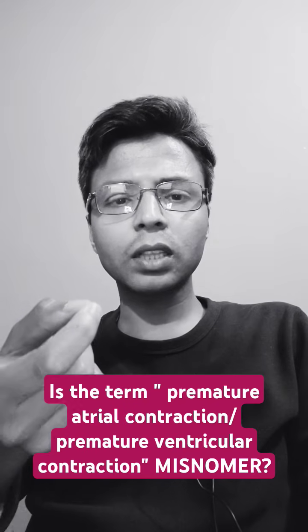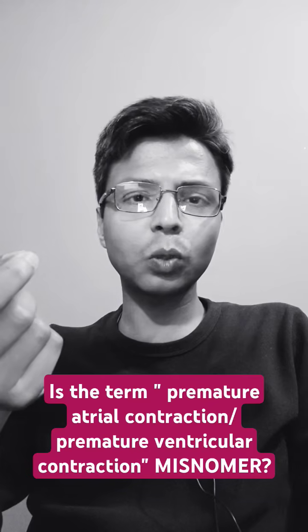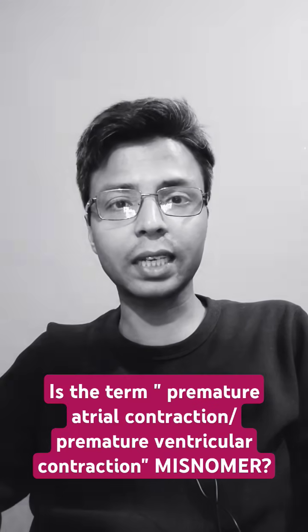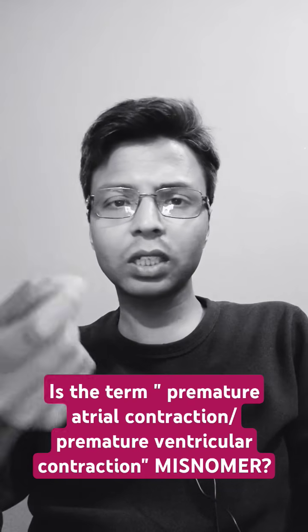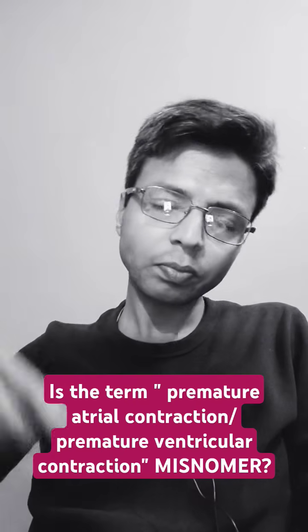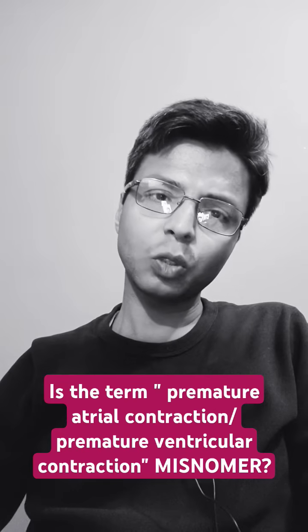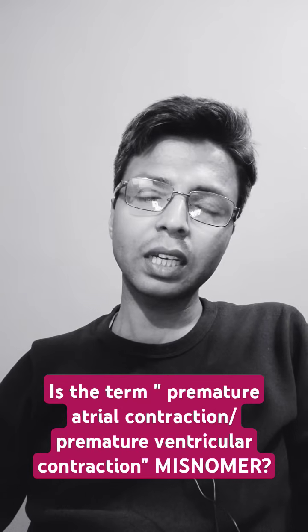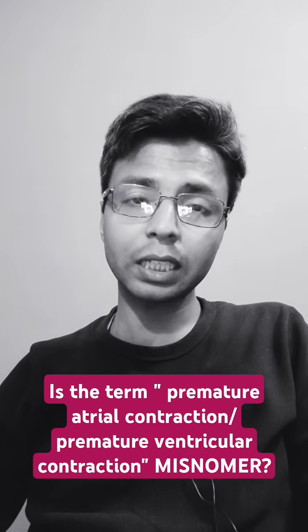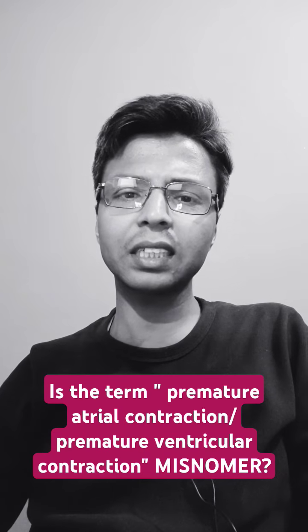So I will call premature atrial contraction or premature ventricular contraction a misnomer. You cannot tell premature atrial contraction; it may not translate into contraction. It is premature atrial depolarization. Right? So if there is premature atrial depolarization in the ECG, it does not mean that there is premature atrial contraction in the heart.